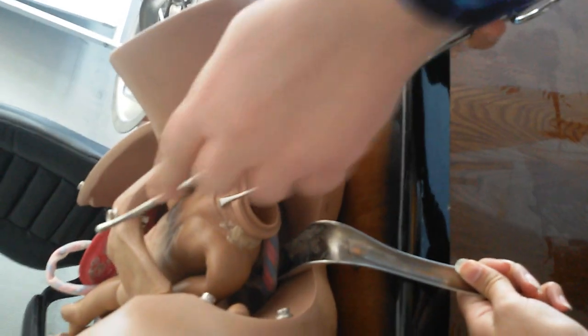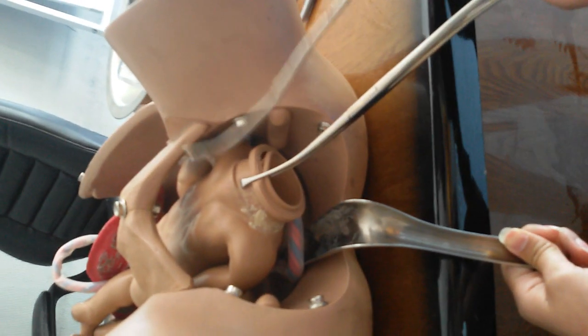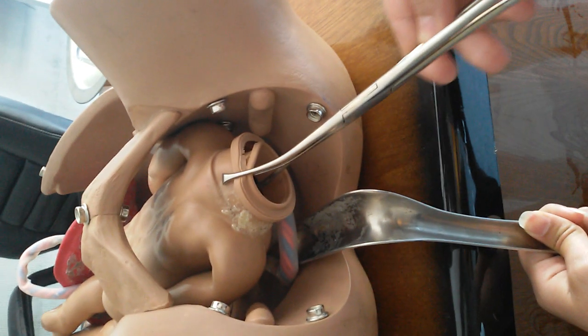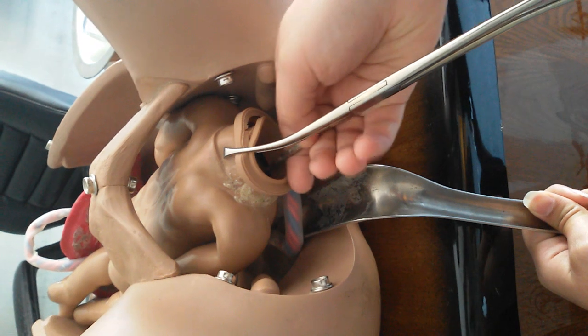After doing this, we insert the instrument called the sound — it has centimeters marked on it — to measure the size and direction of the uterus. Usually the uterus is in anteversion, so we insert it in that direction until we feel resistance. When we feel resistance, we stop and measure the distance from the os of the cervix.